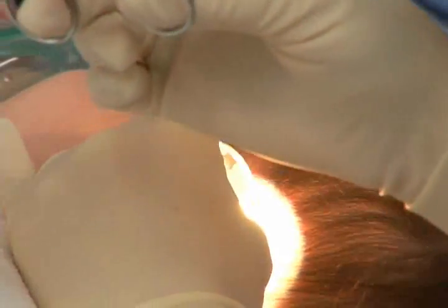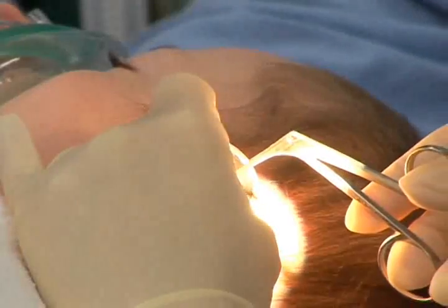Usually we use something called a temporary tube. Temporary tubes just imply that the tube will stay in place approximately 9 months to 15 months. These tubes are designed specifically to be placed in the eardrum such that they cannot fall behind the eardrum. They only fall out of the eardrum when they are no longer needed.